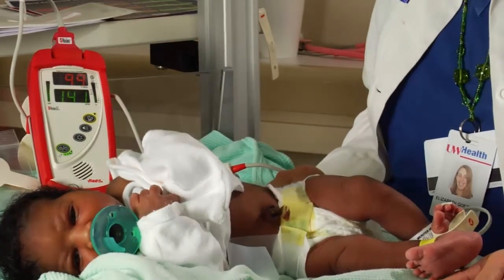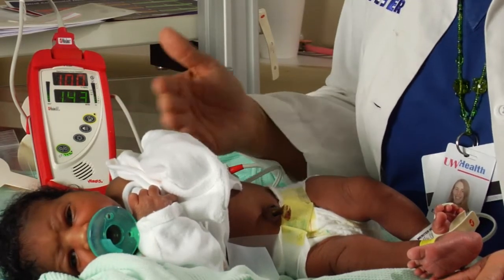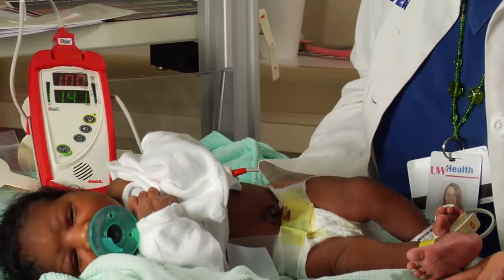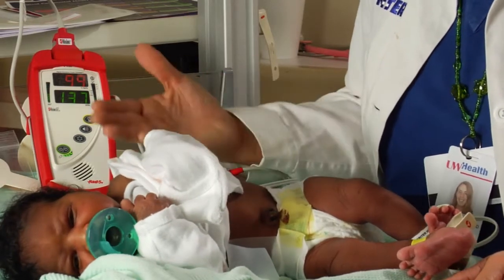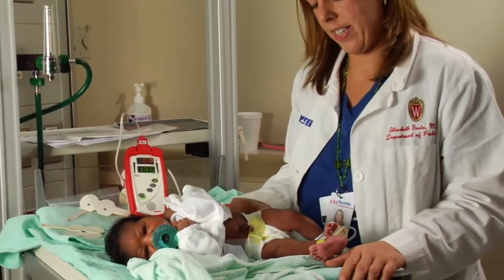One thing to troubleshoot is that if you're getting a low reading for a long time and the heart rate isn't really what you are getting when you listen to the baby, that might be a reason to keep waiting and make sure that the heart rate is reflecting what you know the baby's actual heart rate is. When obtaining the pulse oximetry on the baby, remember that the reading may jump up and down between a narrow range of numbers, say between 96 and 98%. It's okay to use that higher number when you're recording the final result.